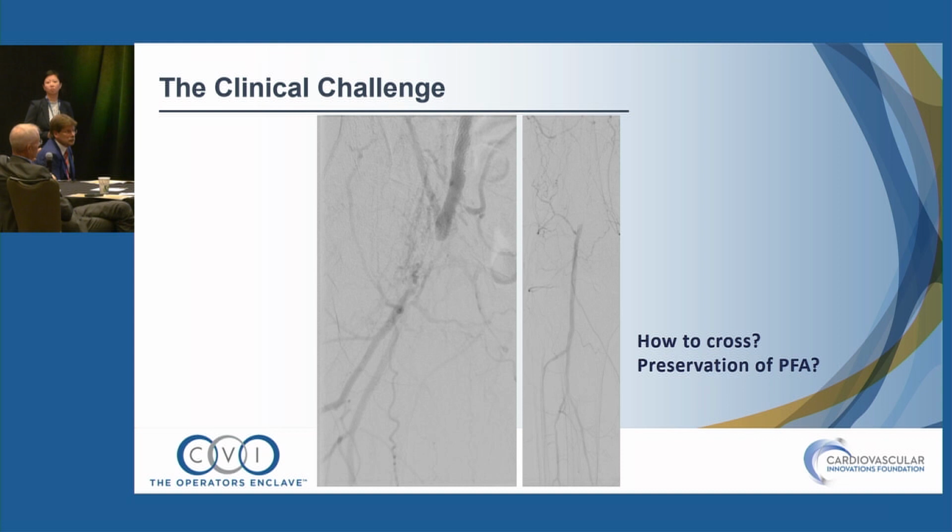The second point I would make is that it's pretty good. We don't see exactly the whole thigh, but there are pretty good reentry collaterals in the popliteal. So the key vessel here is not the SFA, it's the profunda. If you can get a pulse in a profunda, few people wind up losing their legs. We focus a lot on the SFA, but in many ways the SFA is almost a cosmetic vessel.